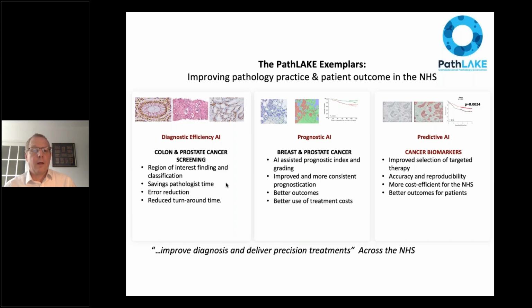In prostate, we were looking to develop tools which could pre-order immunohistochemistry and provide the pathologist at the time of reporting with the sections and stains which are required to report the case. And this avoids the delay of pathologists having to go back and re-examine cases once they've requested the immunohistochemistry.